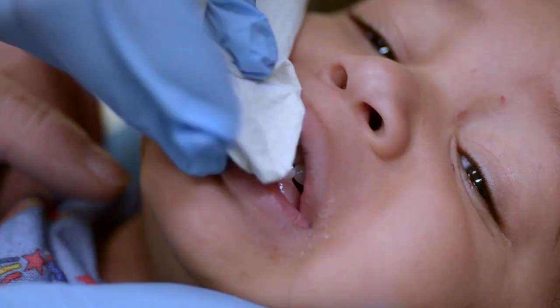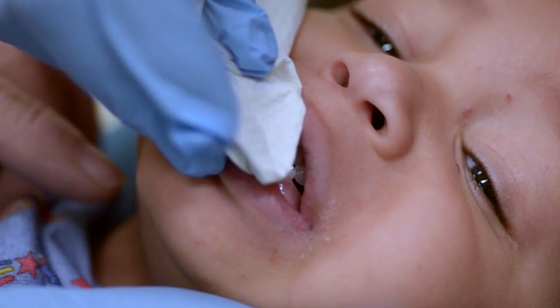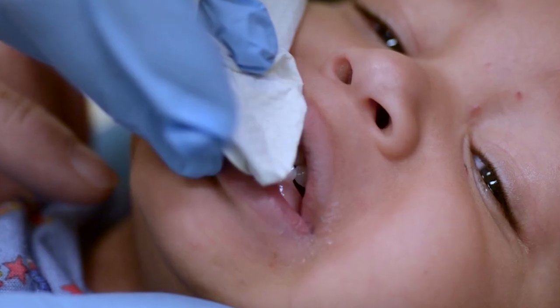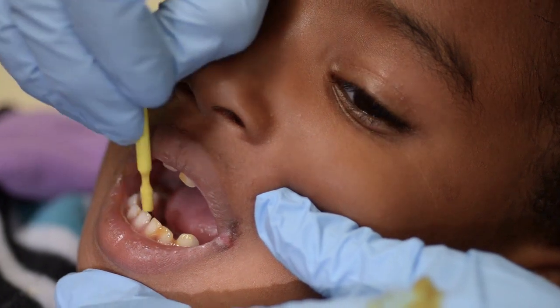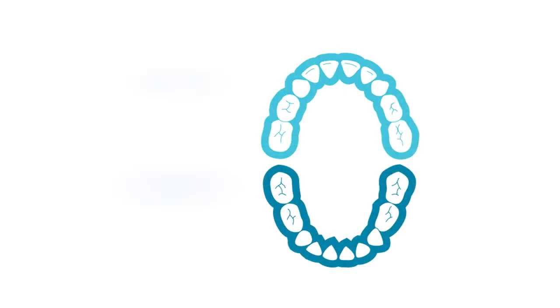Use the gauze to dry excessive saliva from the tooth surface before painting the varnish. It is okay if some saliva is still there, as the saliva fixes the varnish to the tooth surface. Paint all the surfaces of the teeth, both the front and back of each tooth, and be sure to paint the chewing surfaces of molars. Most providers apply the varnish in quadrants to be sure to paint all teeth that are present.